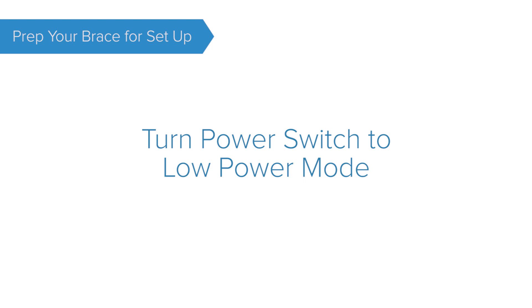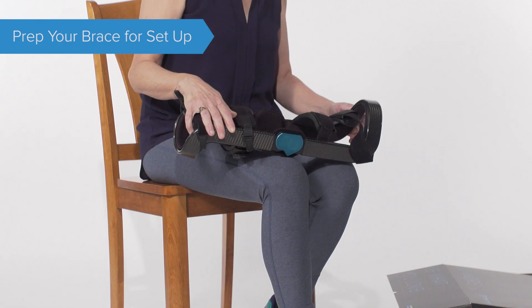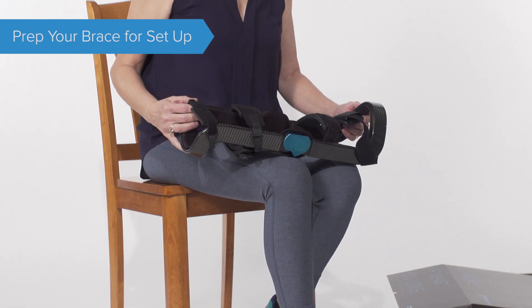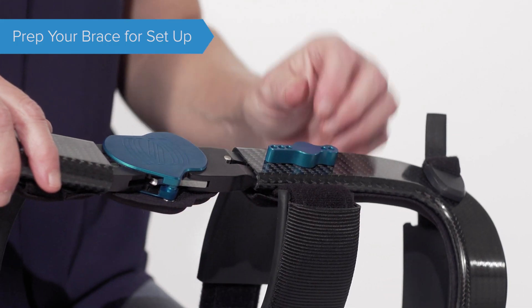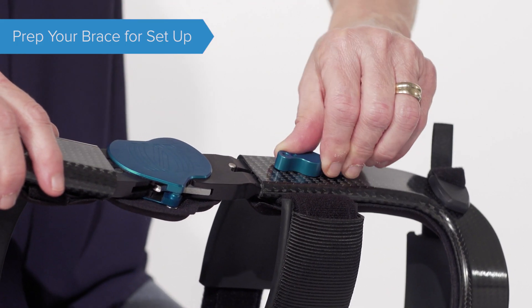Turn the power switch to ensure your brace is in low power mode for initial setup. When changing power modes, your brace must be completely straight. Low power mode means that the two dots on the top of the power switch are facing up.